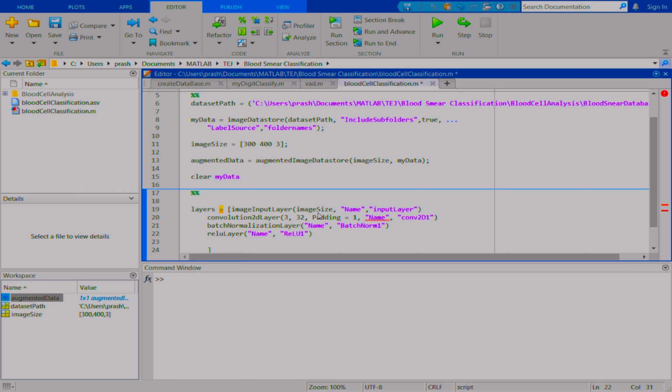ReLU is over. Now once you have the output of ReLU, it is suggested to make a pooling, right? So I should use a pooling layer. If you remember, we have two types of pooling possible. Normally used pooling layers are the max pooling layer and the mean pooling layer. You can go for any one of them. I prefer the max just to hold the highest values.